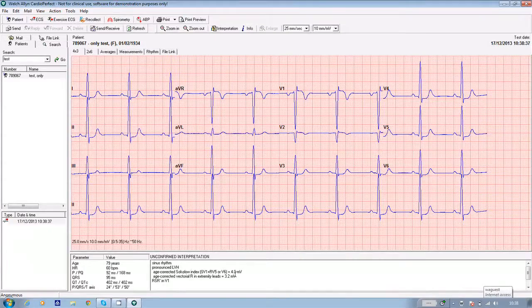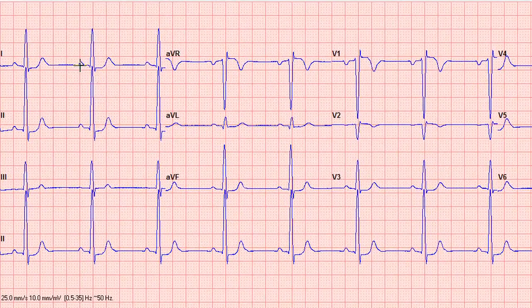After recording the ECG, the test is automatically saved to our software, and a PDF copy of the test can be sent to your file output directory, and from there it can be attached to the individual's patient record. The standard format of the ECG will be 3 lines with 4 leads on each, and at the bottom a lead 2 rhythm strip.